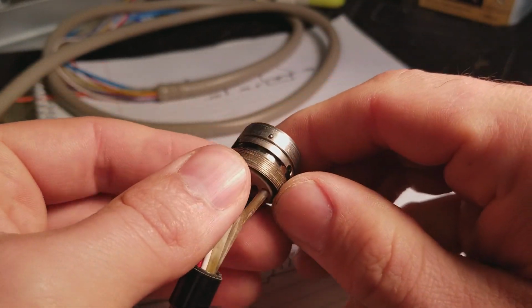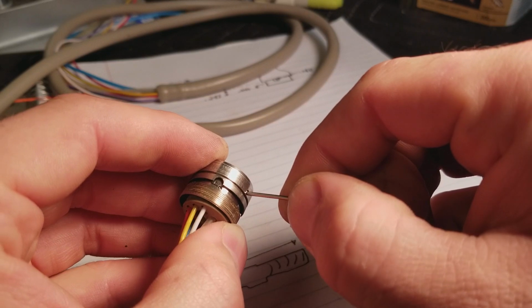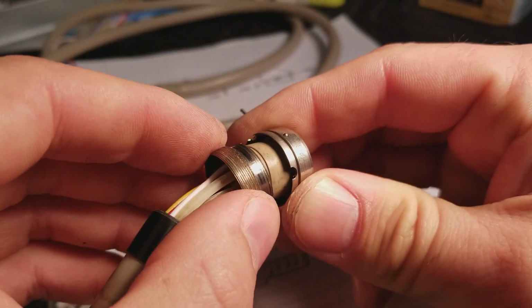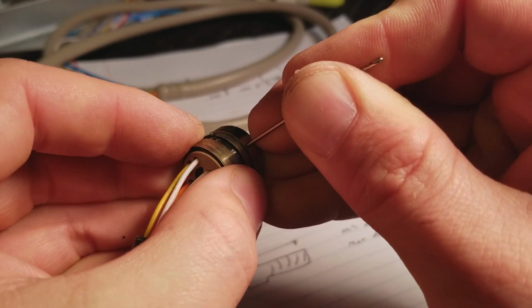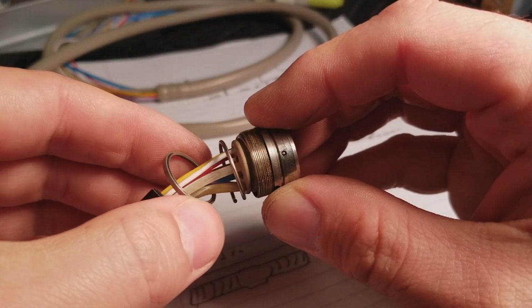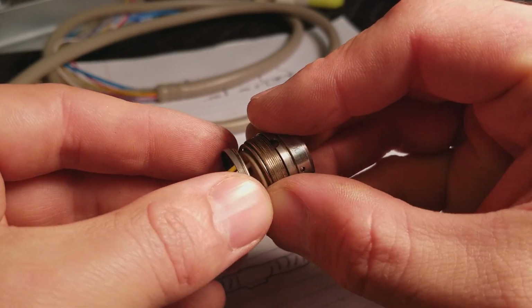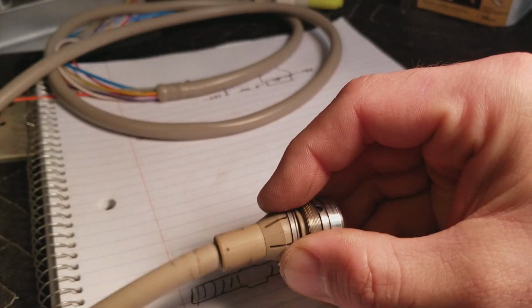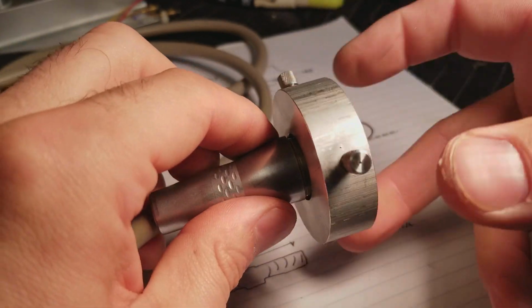So if you try to put this back in, see how it's blocking you out? Well, to get it back in place, simply push this little ball in with an object, and it should just seat right in there. It's easier to do this when I don't have the camera in front of me. There it goes. So it just seated right back up in there. Spring just goes back up in there. This retaining ring goes on the bottom of the spring, basically. So it just kind of seats in there. Like so. This simply snaps back in, then let the ring snap around it. Then screw the nut back in. Put your wrench back on. Tighten it down, and you're done.